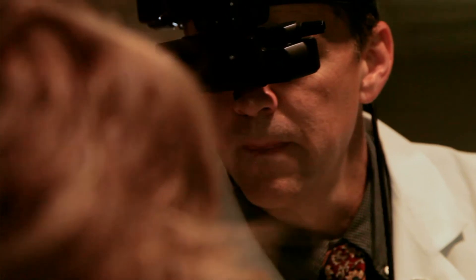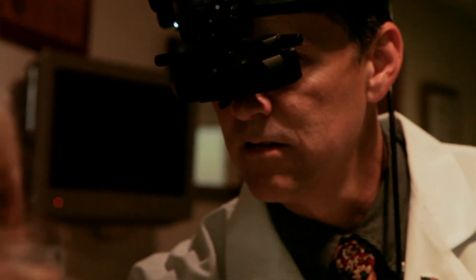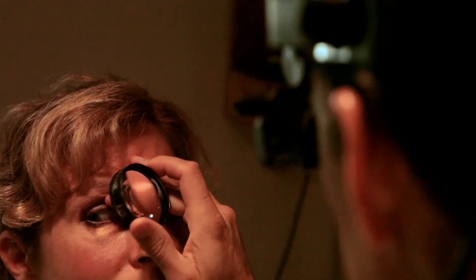Later we'll talk about macular degeneration — it's that little lens we use to evaluate the macula. Then you'll see your doctor put a device on their head called an indirect ophthalmoscope, which is used to look at the peripheral part of the retina, making sure there are no retinal tears or detachment. Those are some of the key things the doctor will be looking for when they use the indirect ophthalmoscope.